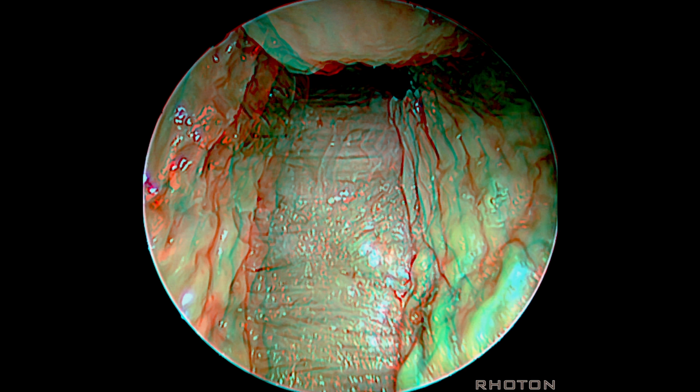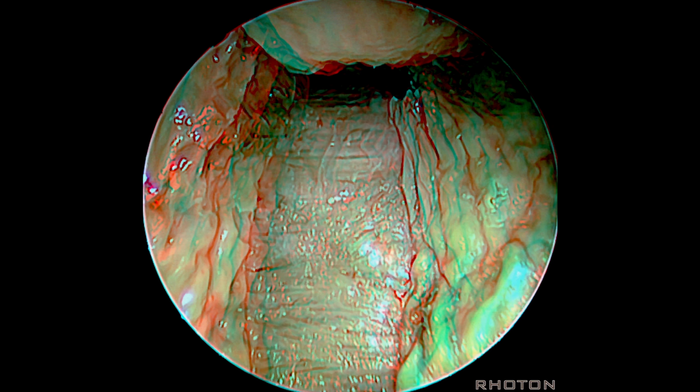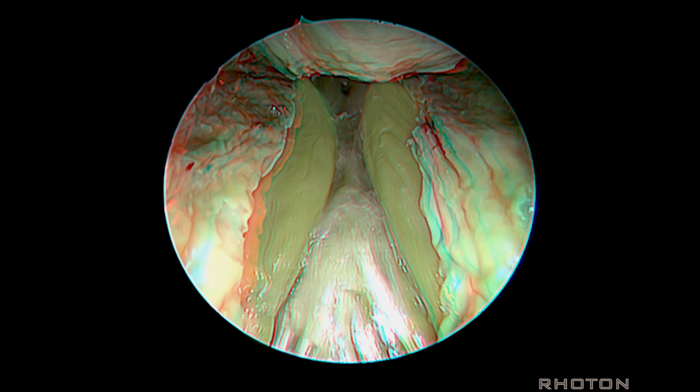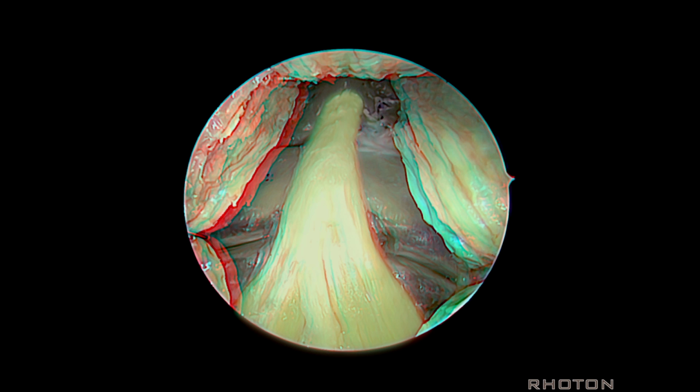Instead of seeing the longus capitis, you see the superior pharyngeal constrictor, which crosses across here from side to side, and you have to look up with a 45-degree endoscope from the oral cavity to see the clivus. It's not straight ahead. Here's longus capitis, and this is longus coli muscles attaching on C1 with a band running up to the clivus.